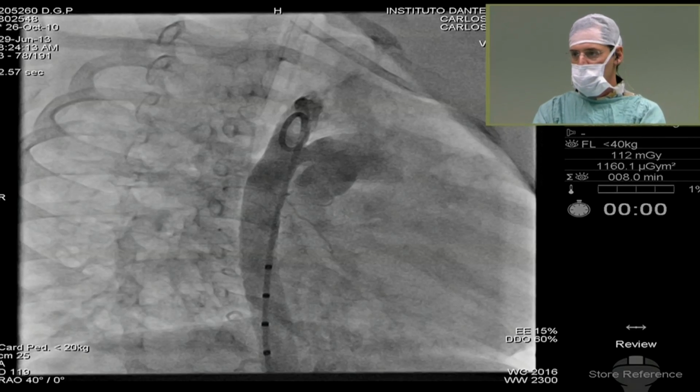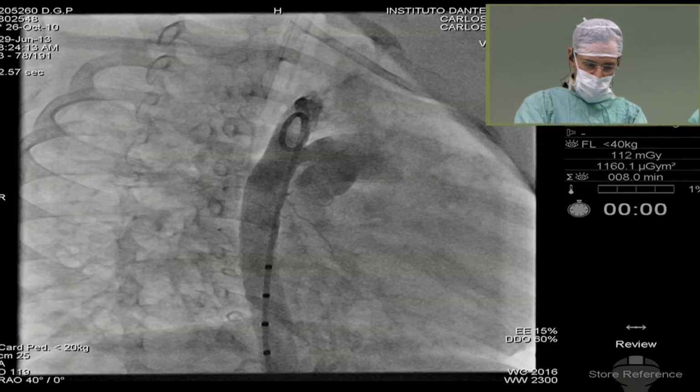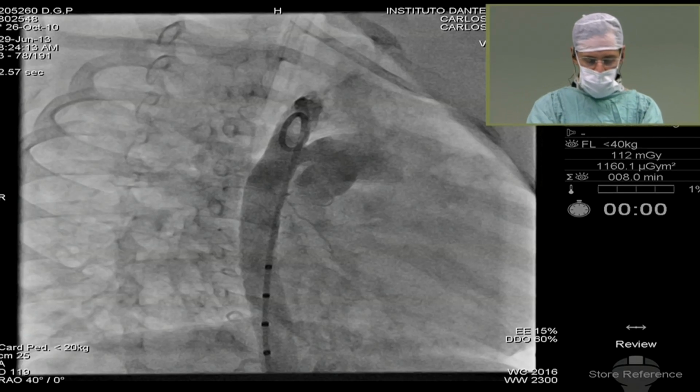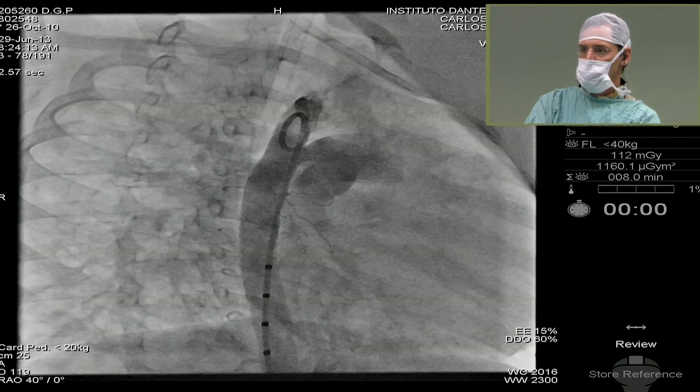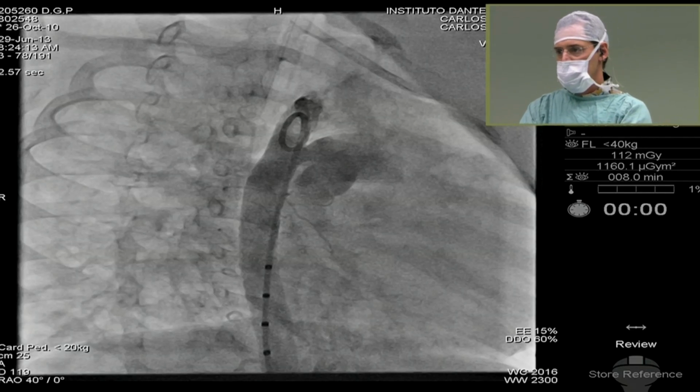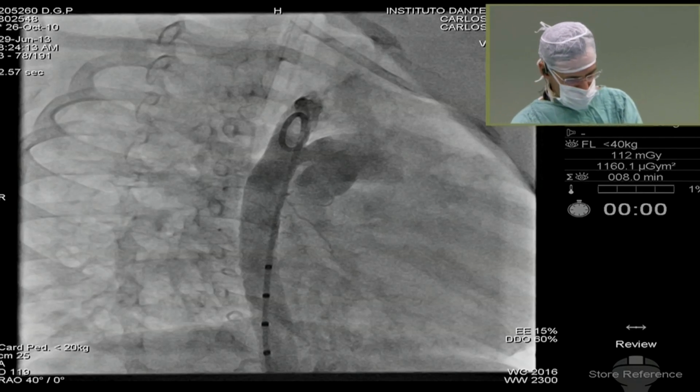This is a big patient. I would think an ADO1, probably 10.8. It's a 10 kilo baby. Oh, 10 kilos. Then maybe an 8.6 if it's a young child. I think if you're getting a measurement of 6, anyway, 10.8 should be fine. Maybe an 8.6 will do it.